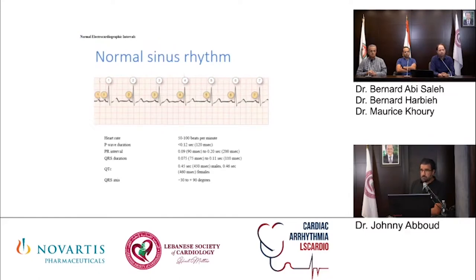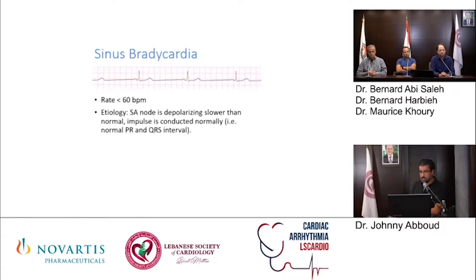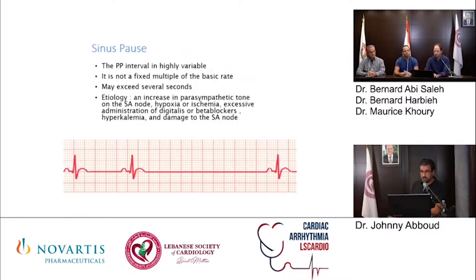So in this patient, we had the EKG. He had sinus bradycardia, like we saw, at 40 beats per minute. It's frequent at his age. We should look for a cause of his sinus bradycardia. Is it secondary to medications that can be reversible, to ischemia, to other diseases? So we should do our full interrogation to be able to diagnose the cause of this sinus bradycardia.